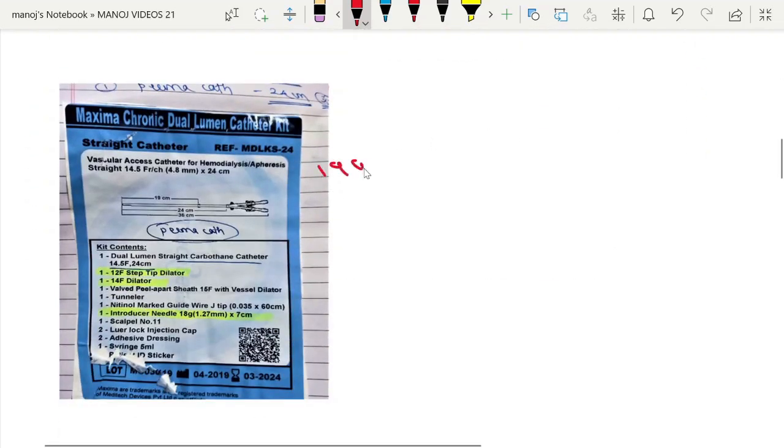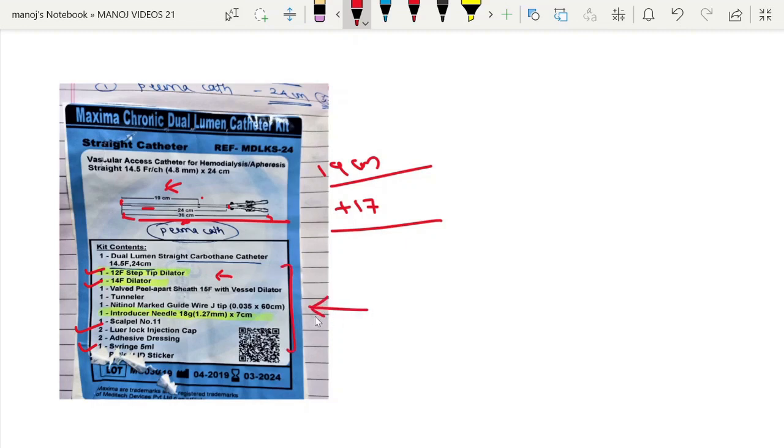Now it is 19 cm perm cath. So 19 cm plus 17 cm will be the total length. Here it is 19 cm, so 36 cm. And from here to here, 5 cm extra. So 24 cm, the total cath is 36 cm. And here you can see the dilator is 12 French and 14 French. The dilator is around 0.5 French lesser than the actual cath. And if you want to see other parameters, you can look at this label. This comes as a pre-packed kit, so all the contents of the kit are over here.